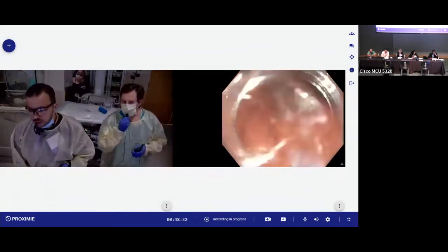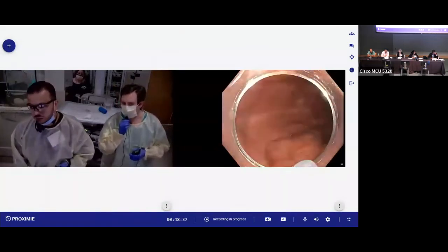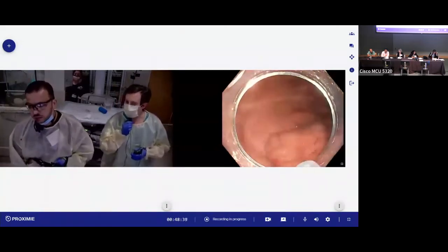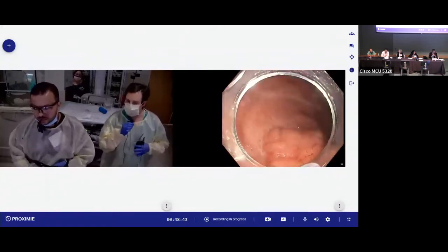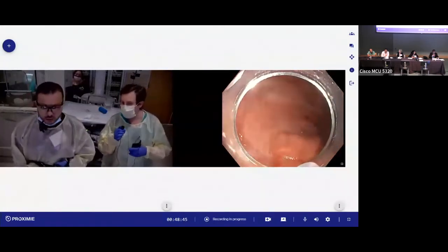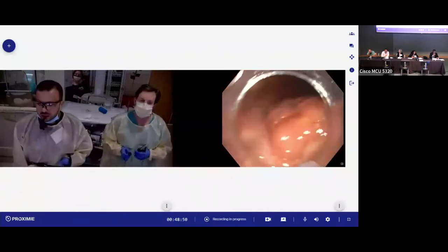So one question I have for you is whenever you do these cases and you're maybe testing with the lift, do you burn any bridges by doing injectate from an ESD standpoint? If you change your mind or somebody tries to take this off and they lift it at first, does that create any fibrosis? Yeah, great question, Jeff.